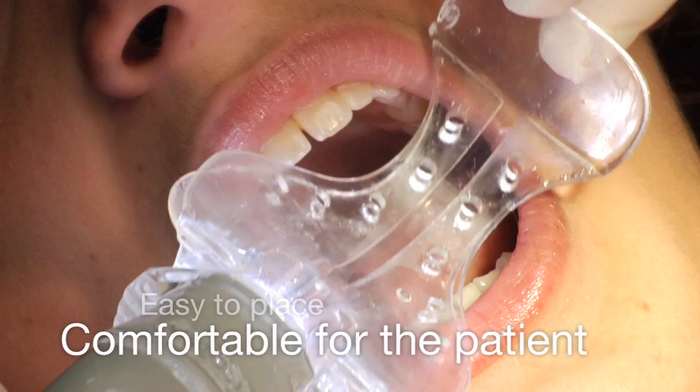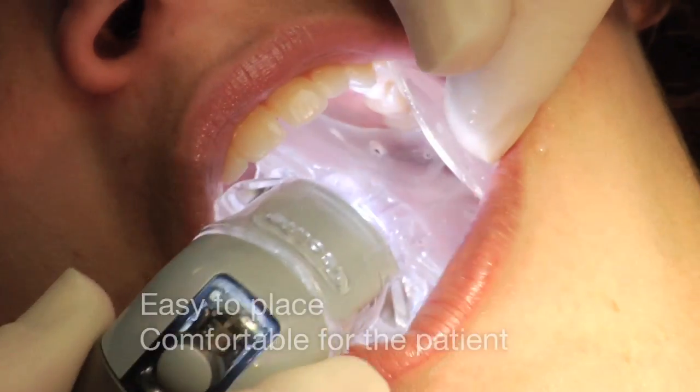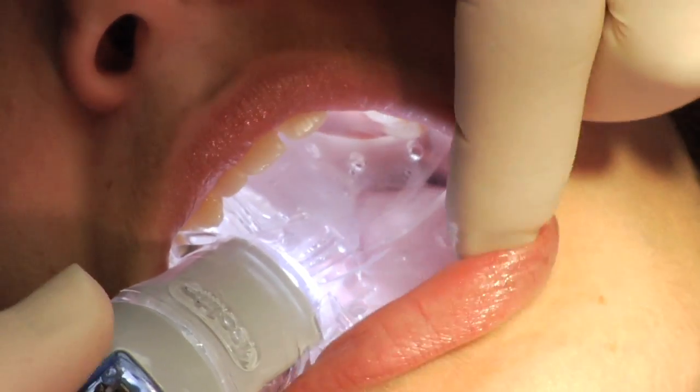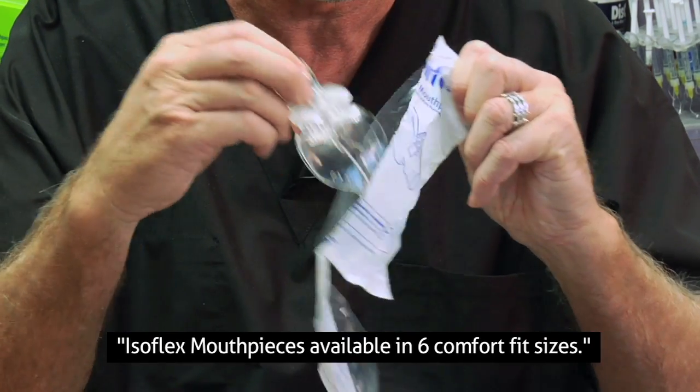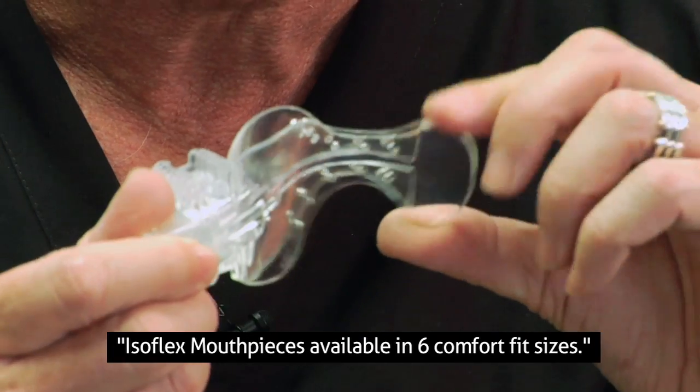Easy to place and comfortable for the patient, the Isolite mouthpiece can be placed in only a few seconds and removed even more quickly. Economical, single-use mouthpieces mean no risk of patient cross-contamination.